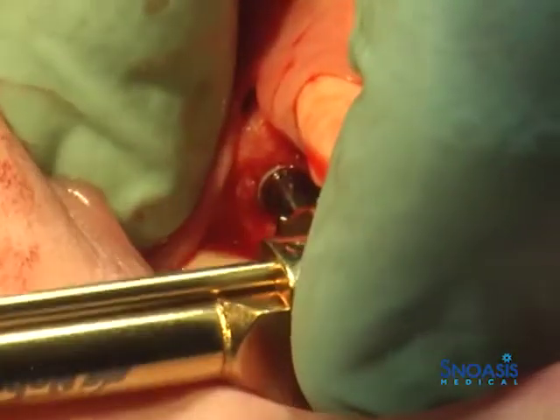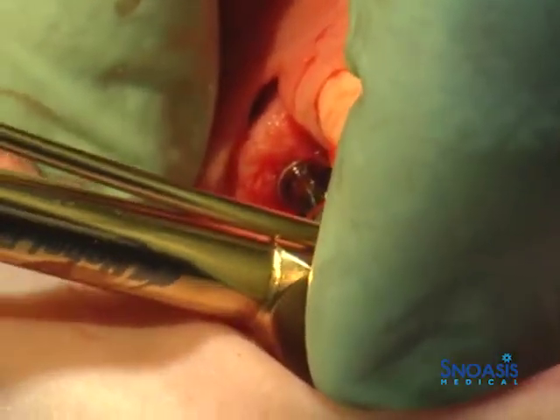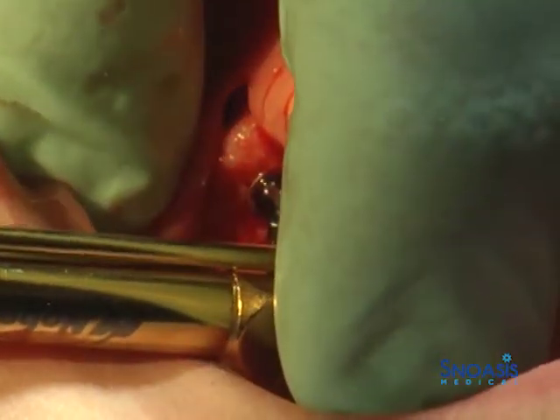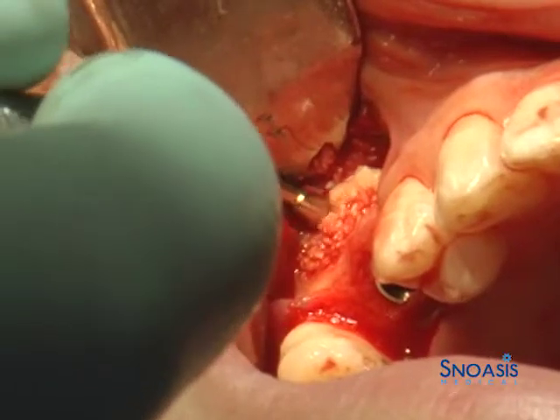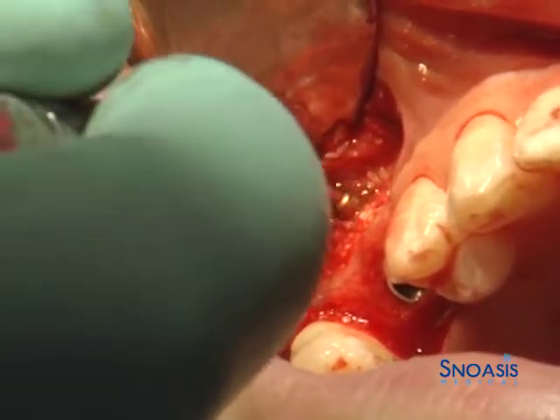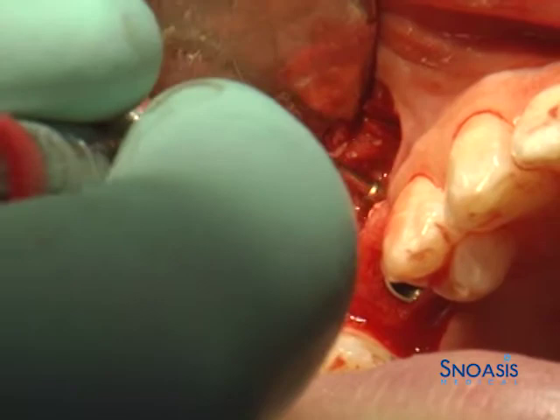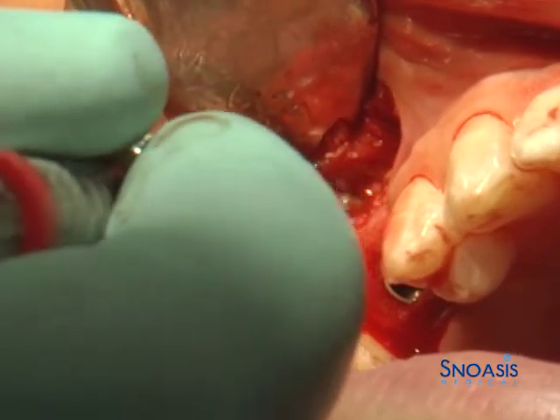A hand torque wrench is used per the Nobel Active Protocol for placement of a simultaneous implant in site number 4. Final bone allograft and xenograft is placed into the sinus cavity and compressed around the implant, adequately elevating the Schneiderian membrane as well.